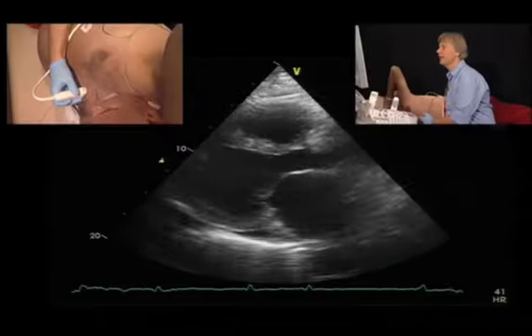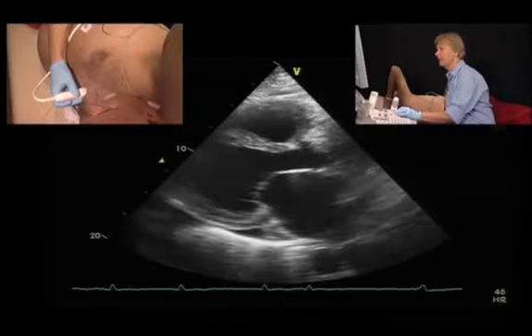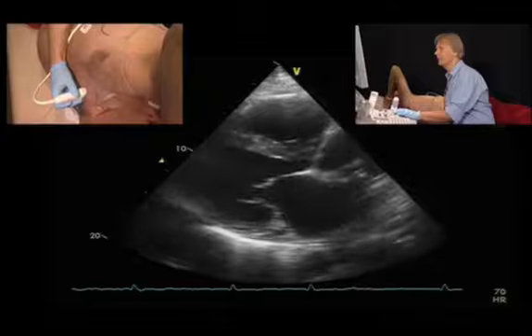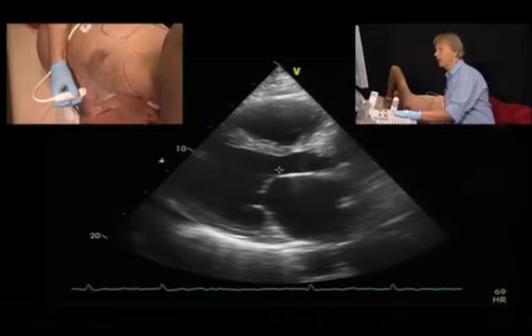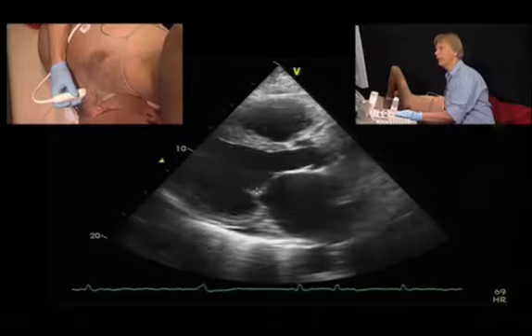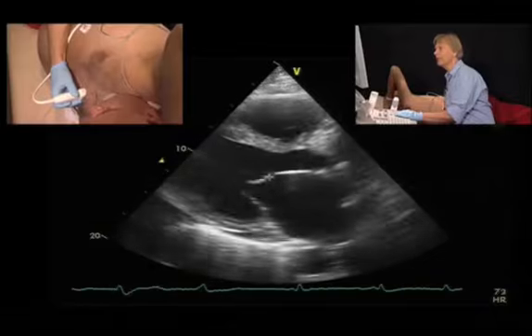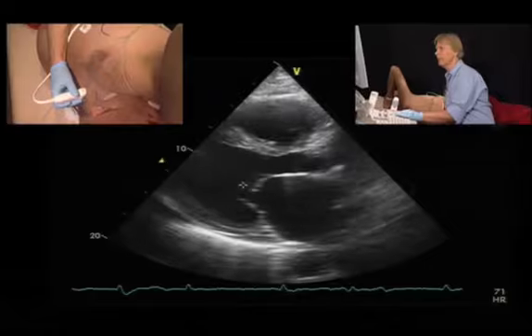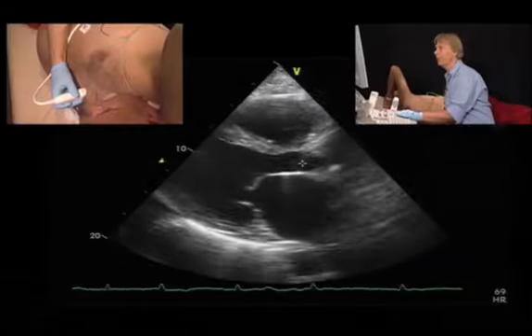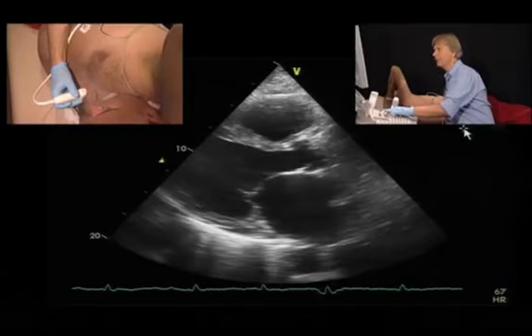Here's a patient where I want to show you some practical issues when you assess left ventricular size and function. Let's first start with the parasternal long axis view, and just by looking at this view you can clearly appreciate that there is significantly reduced left ventricular function. But also take a look at the mitral valve. We have a myopathic motion of the mitral valve. It does not seem to open completely, but not because it is stenotic, but simply because we have low output or low flow. And the same is actually also true for the aortic valve.